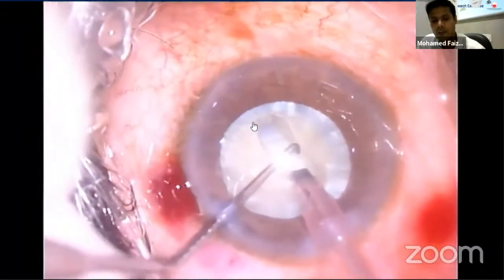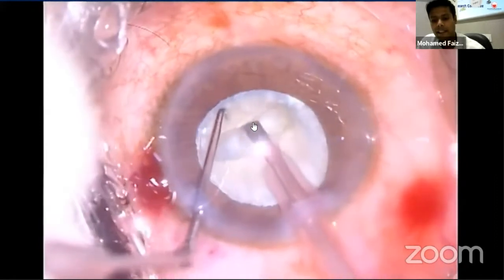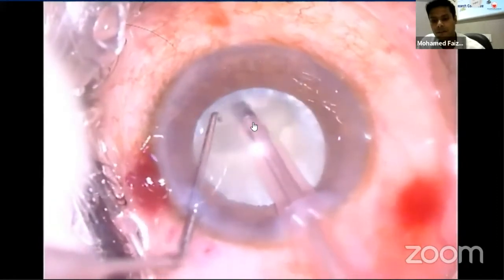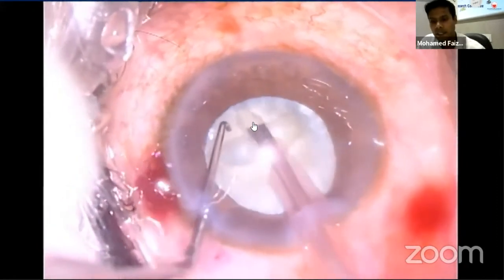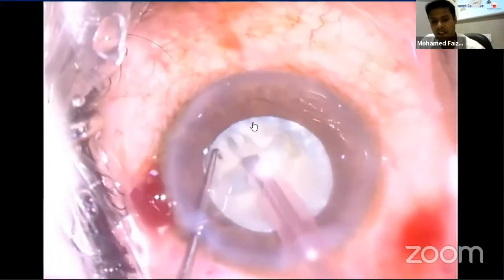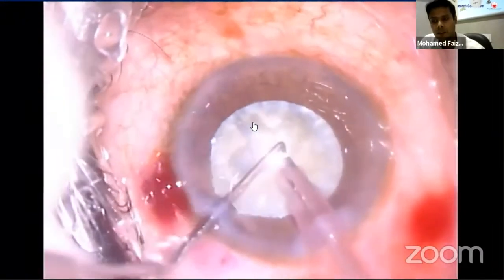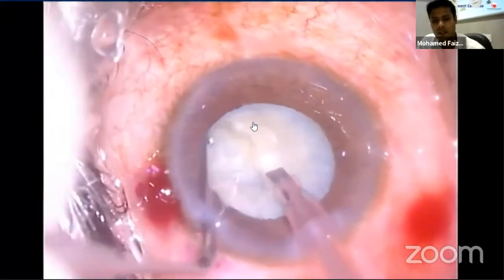The nucleus is rotated and the groove is extended. A second groove is then made 90 degrees to the first groove. A clear reflex in comparison to the rest of the nucleus indicates satisfactory depth, after which you should not deepen further.